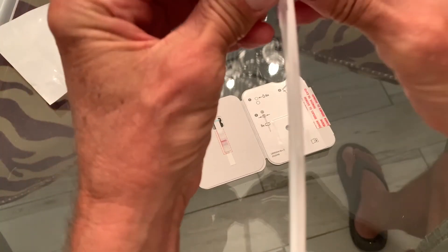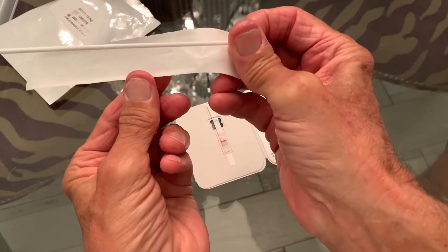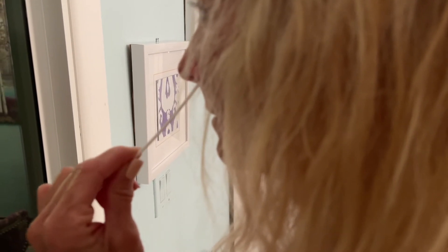Now we've got to open up our swab and have our assistant swab it into her nose. Don't touch that side of the swab with anything other than her nose. Insert it three-quarters of an inch up the nostril, rub it for 15 seconds on one side, twisting and turning as you go. Now switch nostrils — get the other nostril, keep going and twist and turn it, making sure it's three-quarters of an inch up. Not into the brain! Keep swirling — you've got another five seconds. Okay, pull it out — don't hit me in the face with that thing.